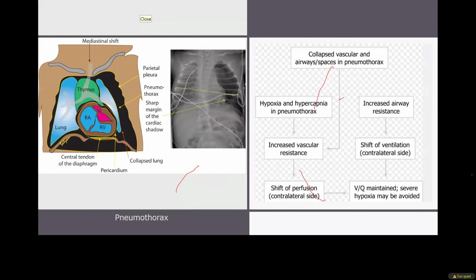What happens in a baby with a pneumothorax? In the baby with pneumothorax, I think the best strategy is not to give tidal volume ventilation, which is the conventional ventilation. The best strategy would be to give high frequency ventilation, where the tidal volume is extremely tiny, there's less volume trauma, and you're not going to increase your air leak. And the high frequency is the best strategy for this, either pneumothorax or pulmonary interstitial emphysema, any of the air leak syndromes, it would be the high frequency ventilator.